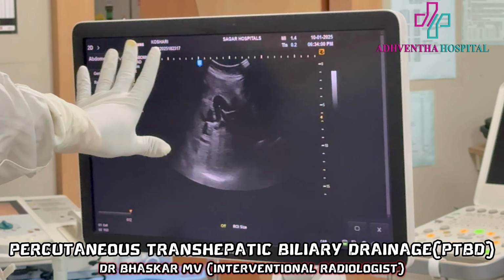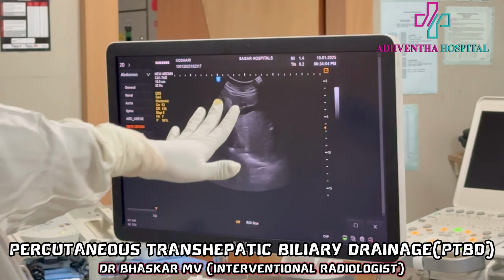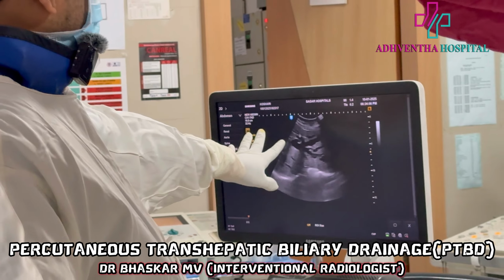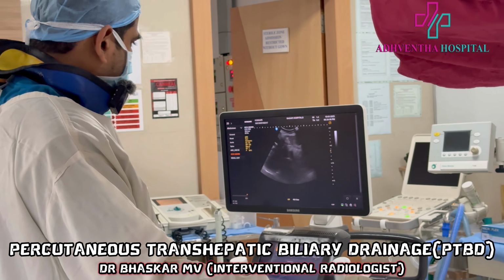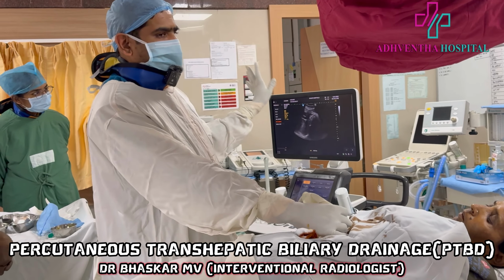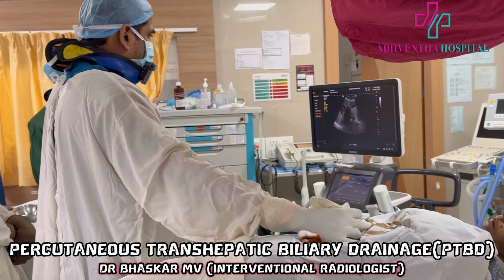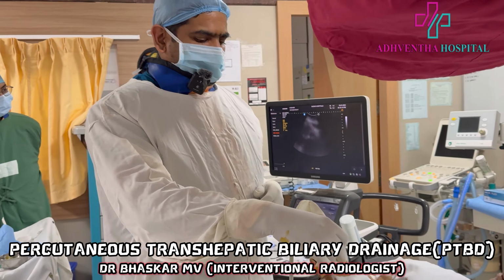These are the right lobe ducts dilatation, very gross, and these are the left lobe. And we can see the confluence is partially seen, but CBD is not seen. That means there is a big mass sitting in the hilum of the liver. So now the plan is to relieve the jaundice of the patient first.